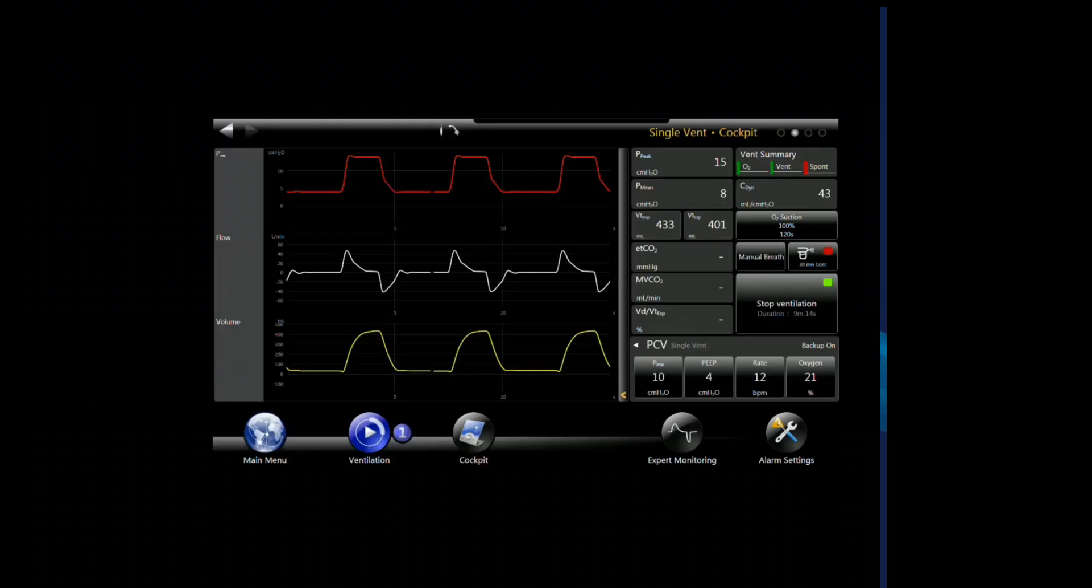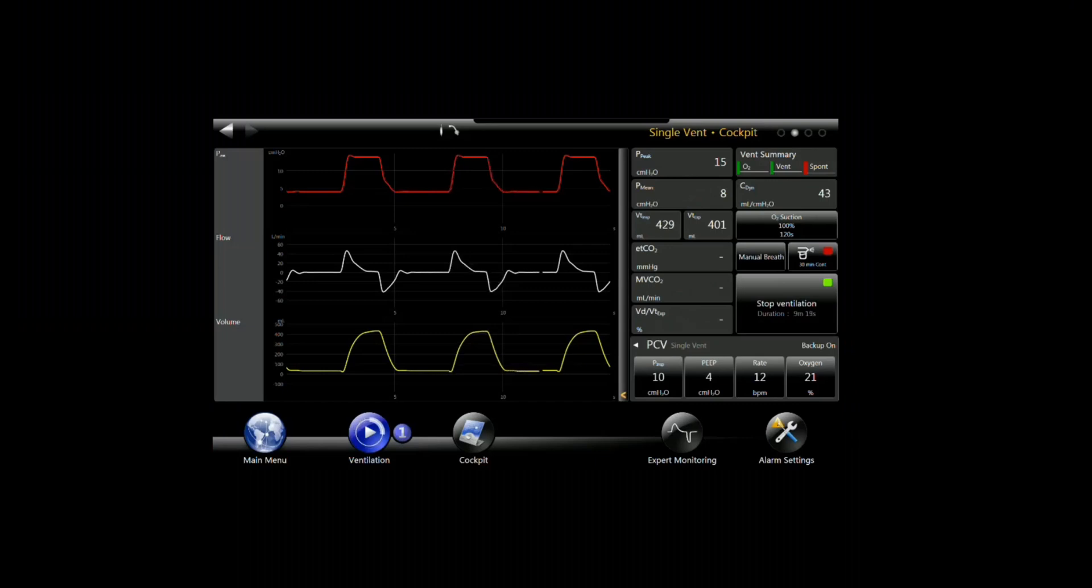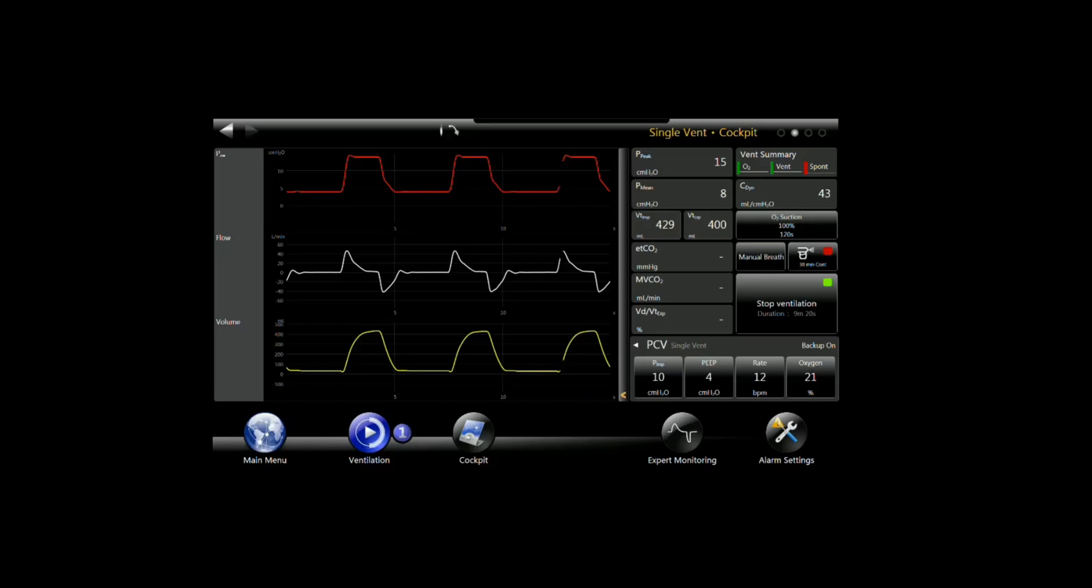We're going to start off with a short video about connecting the sensor and setting up the Bella Vista for capnography. You'll notice in looking at the monitor parameters here for end tidal CO2 that we don't have a sensor in line yet.